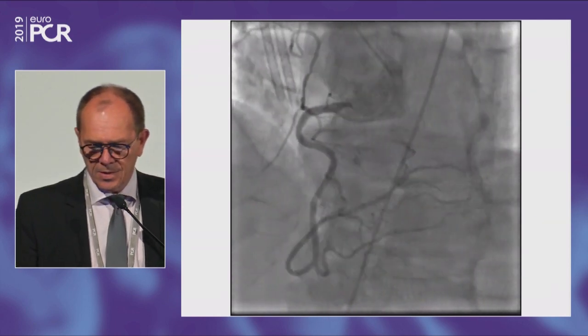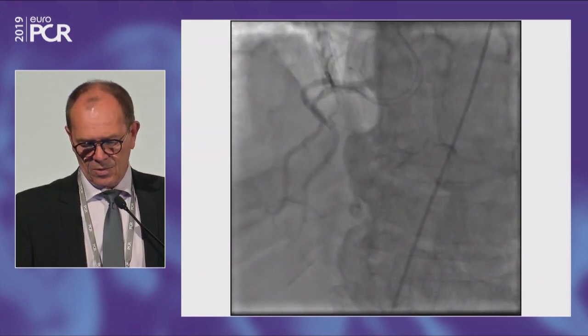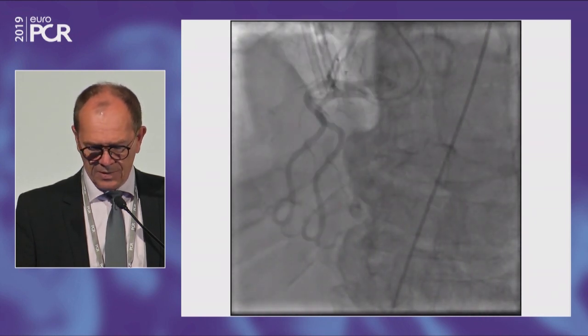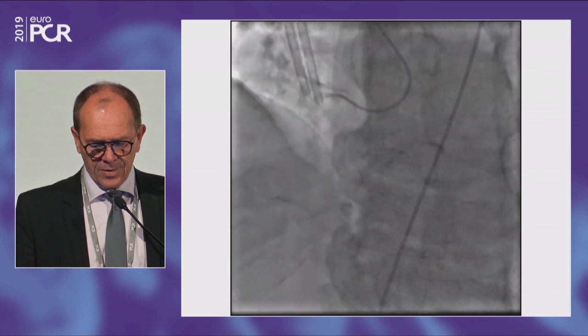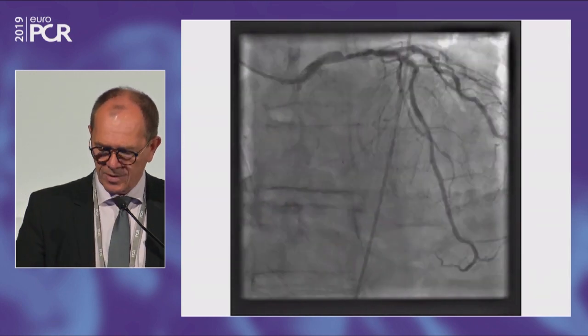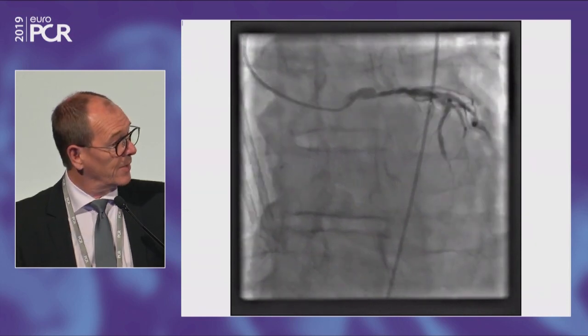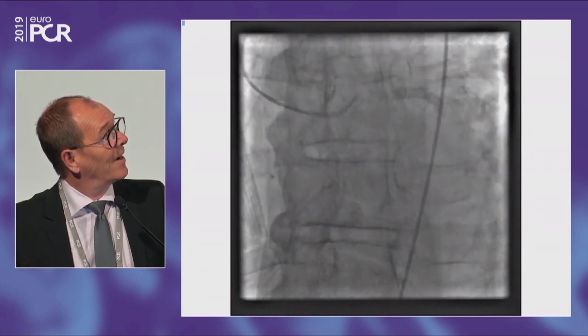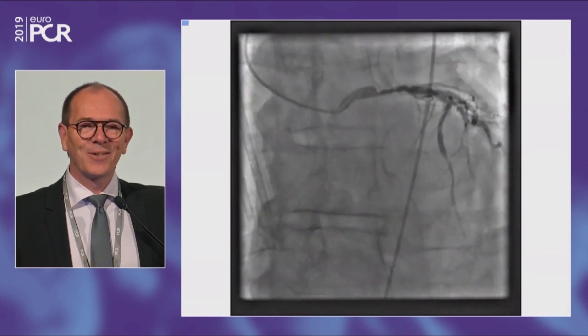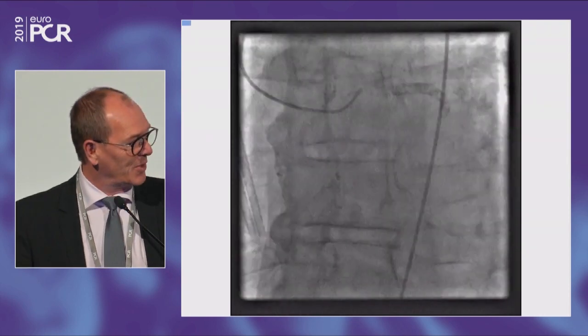And we can see this is a big right coronary artery with some atheroma with no significant disease, but we can see also the small calcification on the proximal part. And on the left, before the injection, you can see a severe calcification. That's a good guy, yeah? Good candidate for such kind of presentation and discussion.